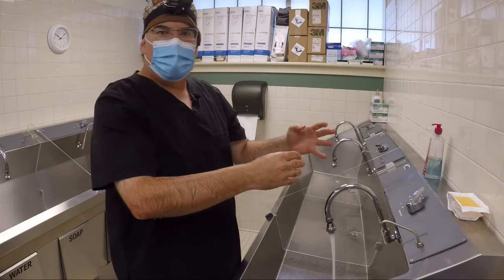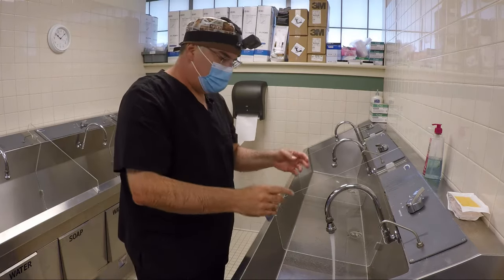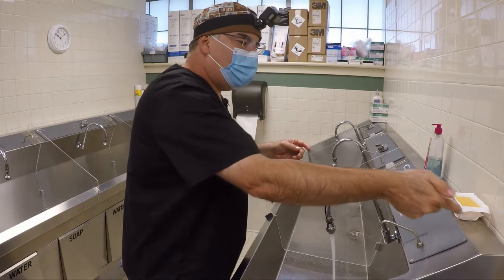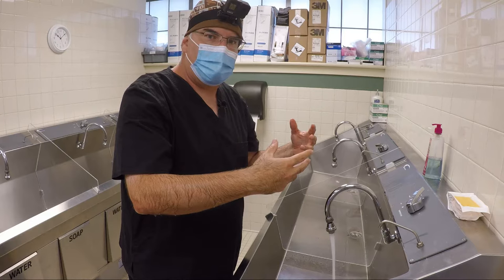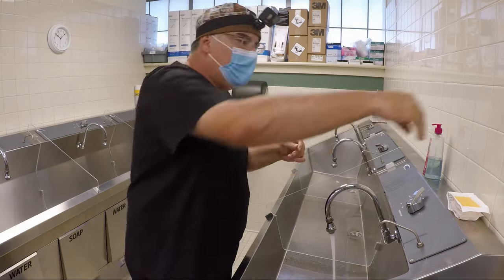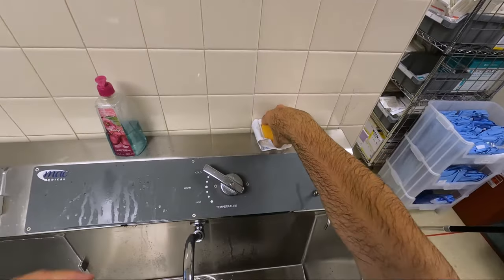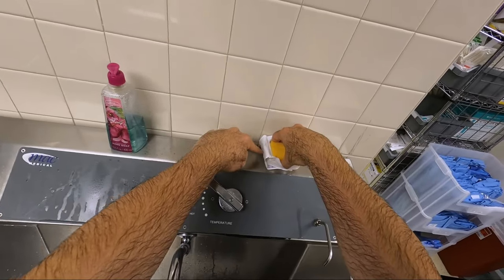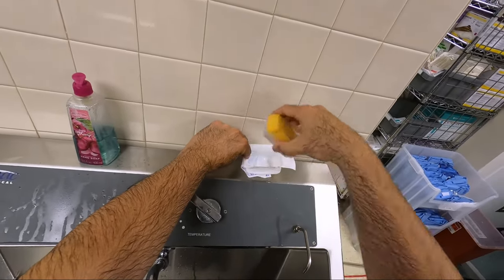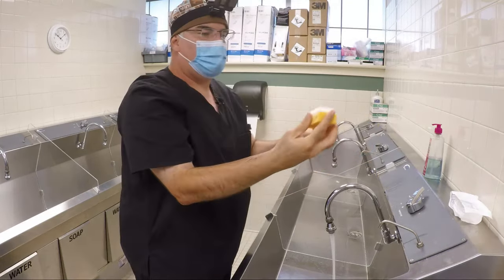Good. At this point, we're about to actually start our scrub, so we have to be very careful what we touch and what we don't touch. So I now have to get the sponge out of that little holder there, and I don't want to touch anywhere on the side because at this point I'm starting my scrub, and if I touch anything, it's going to contaminate. So the inside of this packaging is clean, so I can stick my fingers in like this and pull the sponge out. If you have trouble getting it out, see this side right here, this lip where the top is folded over? That was inside, so you're still okay to touch that, just not anywhere outside of this. So this one point on the package, that's where you can touch to help pull this out.